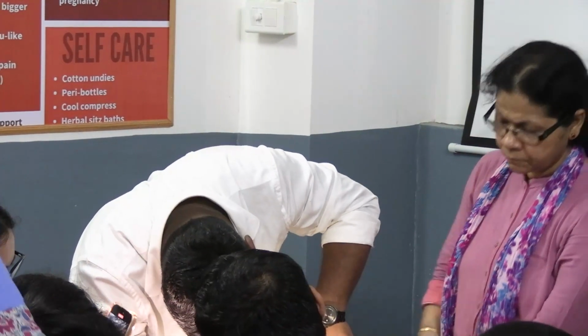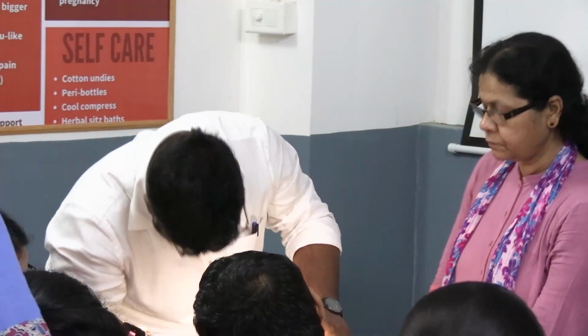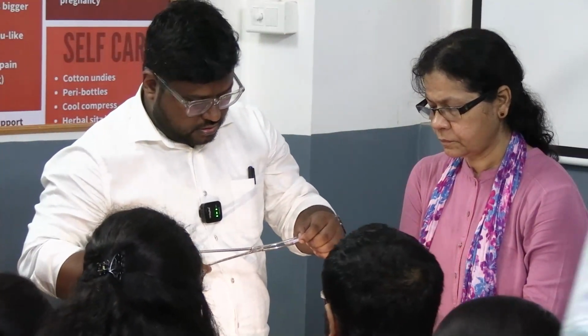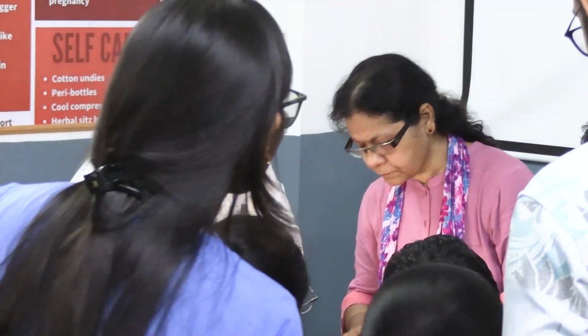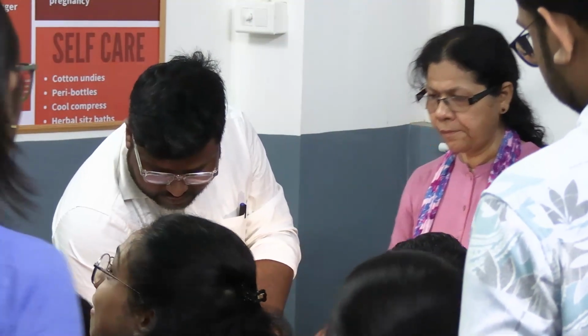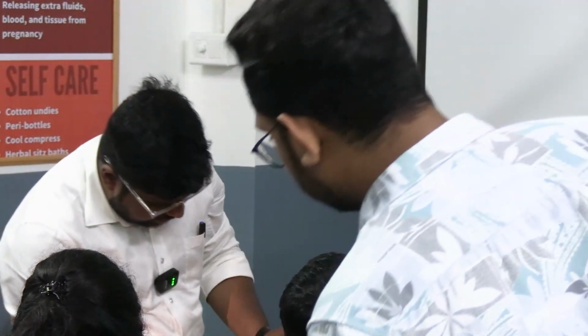This is your anterior lip. এটাকে ধরা হয়নি ঠিক করে? না ধরেনি। This is it goes inside. ঠিক আছে? You take this. Take an instrument. চলে গেল উপরে, ঠিক আছে? আমার হাত থেকে এই যে into the uterus. Leave. Come out. That's it. Hold. Go inside. Leave and come out. As simple as that. তার আগে রিট্রিভ করে যেটাকে দিয়েছি। কোন দিকে গেছে?